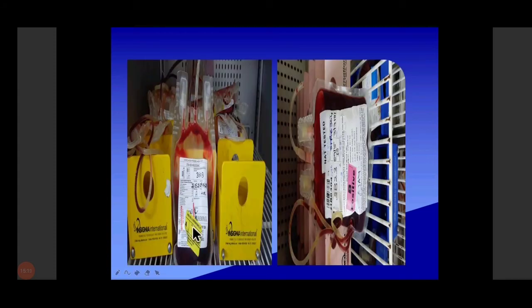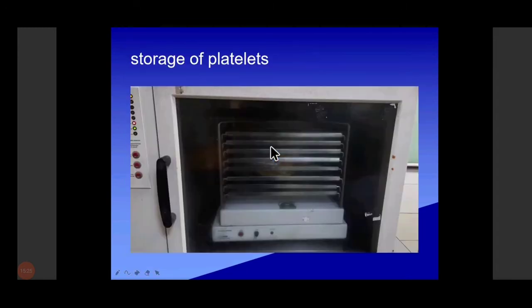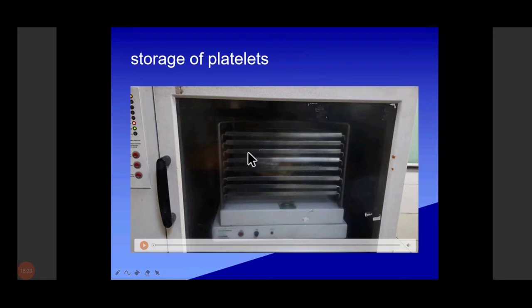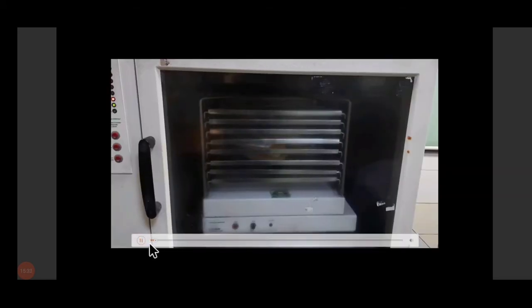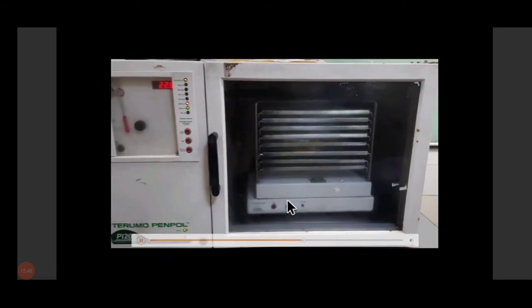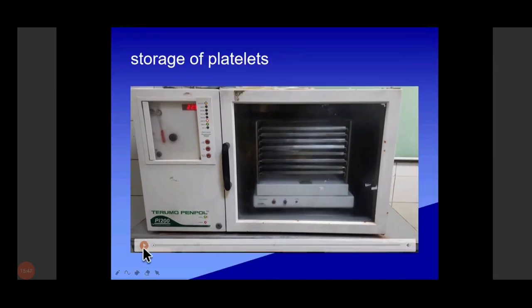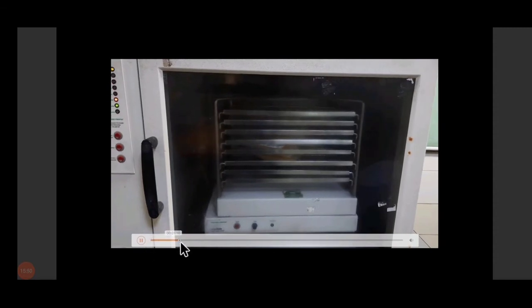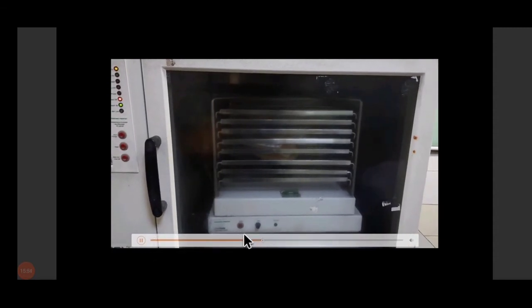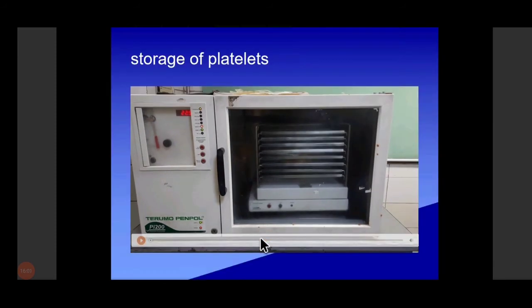In our blood bank, A blood group is yellow-labeled, B is pink, and AB is white. O positive is blue. Platelets should always be agitated. If they are not agitated, bacteria will grow at room temperature. We maintain constant agitated motion for platelets to prevent microorganism growth. When you collect platelets, keep them agitated until patient transfusion.